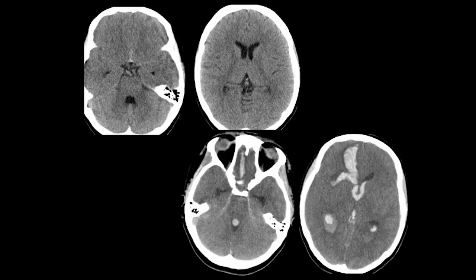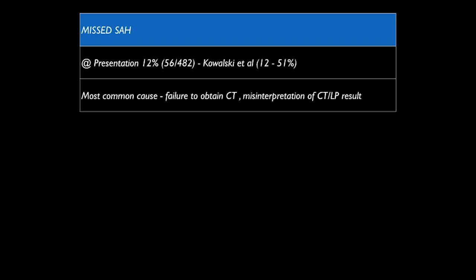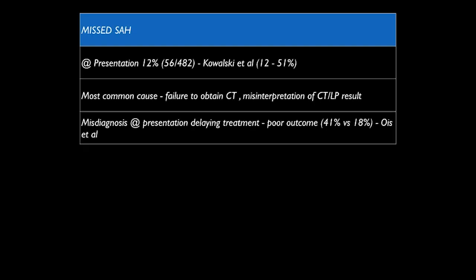However, the patient presented with another episode of subarachnoid hemorrhage, and this time the bleed extended into the parenchyma and the ventricle. There was a sudden increase in intracranial pressure and the patient did not manage to reach the tertiary center. This was a case of missed subarachnoid hemorrhage, which is not uncommon — it is seen at presentation in about 12% of cases, most commonly due to failure to obtain a CT scan or misinterpretation of CT or lumbar puncture results.